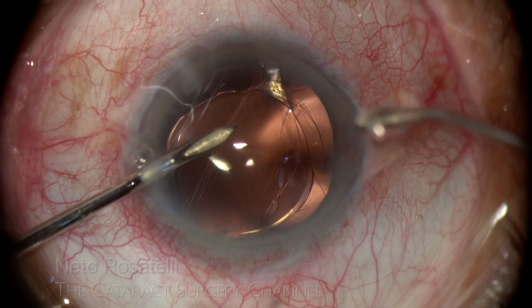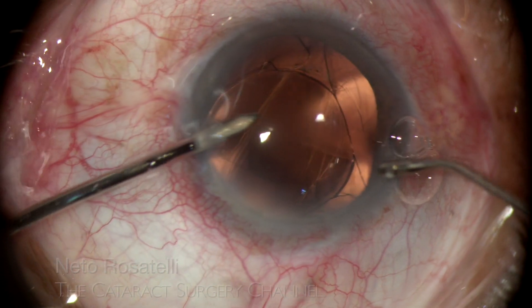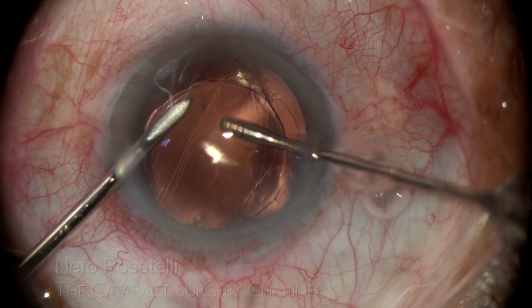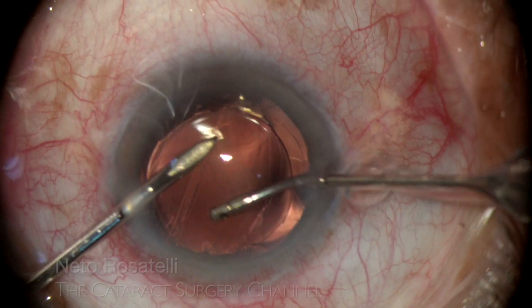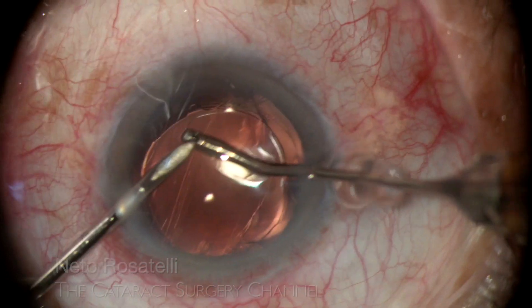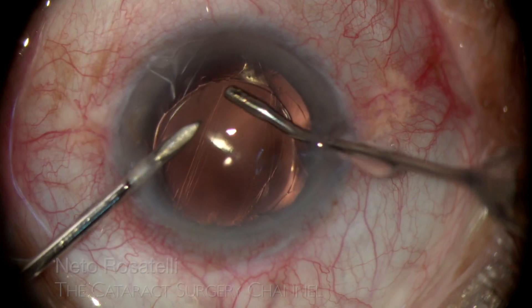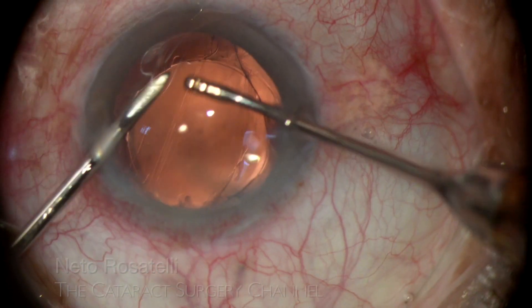I begin to carry out OVD evacuation with a bimanual irrigation-aspiration probe. OVD evacuation must be thoroughly done in order to avoid IOP spike in the post-op period, and I carefully aspirate and irrigate the angle and the sulcus all around. By tapping the IOL-capsular bag complex, I confirm its stability.